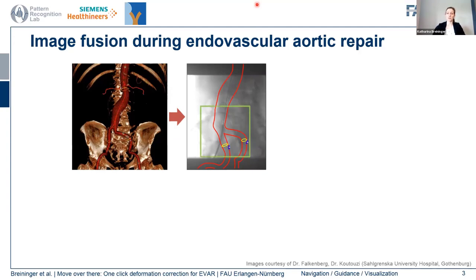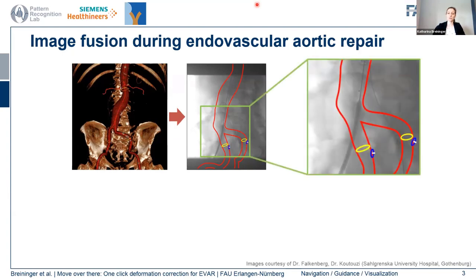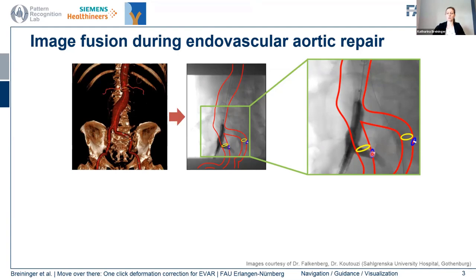However, as you can see in this example, the instruments introduced during this procedure actually deform the vasculature, so we see a considerable deformation, and this reduces the value of the fusion considerably. Especially at vessel bifurcations highlighted here with a contrast injection, the preoperative information — where the corresponding landmark is denoted in blue — no longer matches the true intraoperative situation. This is an issue especially for critical points like stent placement.